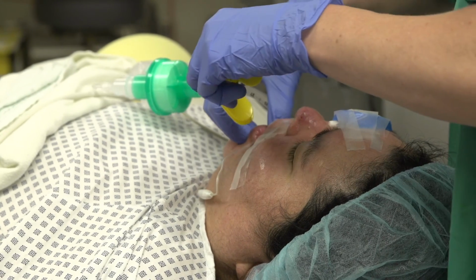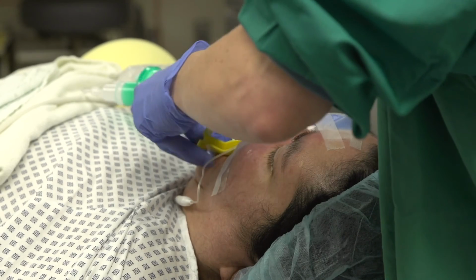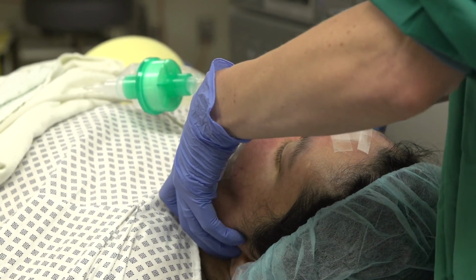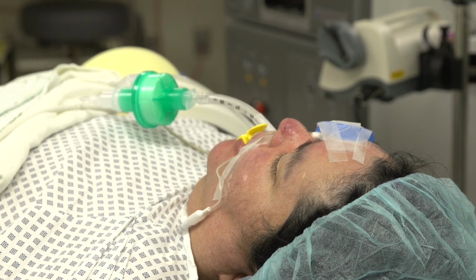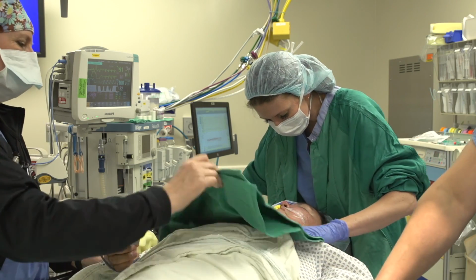Use a bite block. In vigorous spontaneous ventilation, biting on the endotracheal tube or LMA could greatly increase the chance of a patient experiencing negative pressure pulmonary edema. Discontinuing ANEclear before the patient is completely awake can slow recovery. Monitor your patient for the classic signs of emergence from inhaled anesthesia and extubate based on your best clinical judgment.